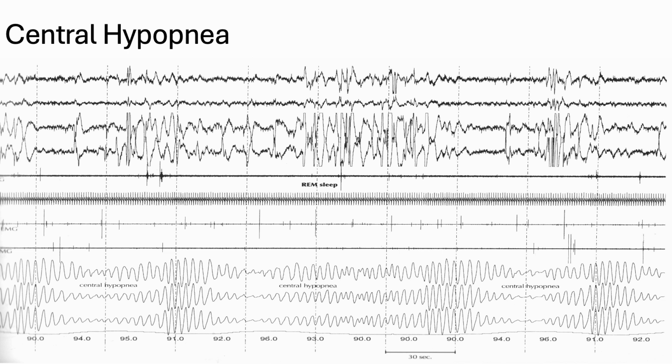There's something about REM that oxygen can be a real tough cookie to solve, much more so than non-REM. It's probably a combination between the different part of the brain that controls breathing during REM, as well as the paralysis of airway muscles.